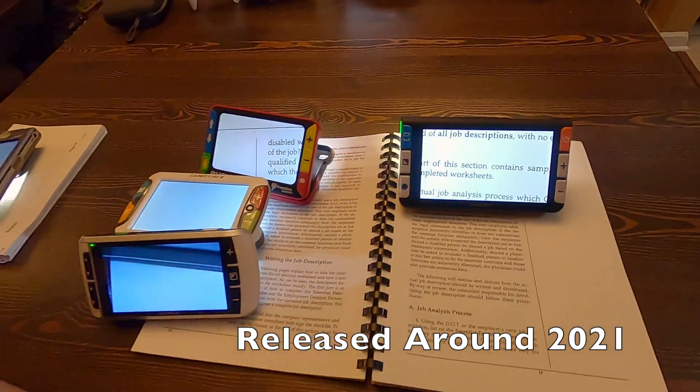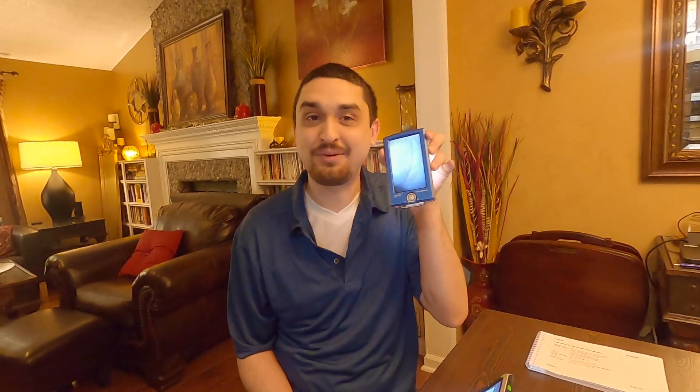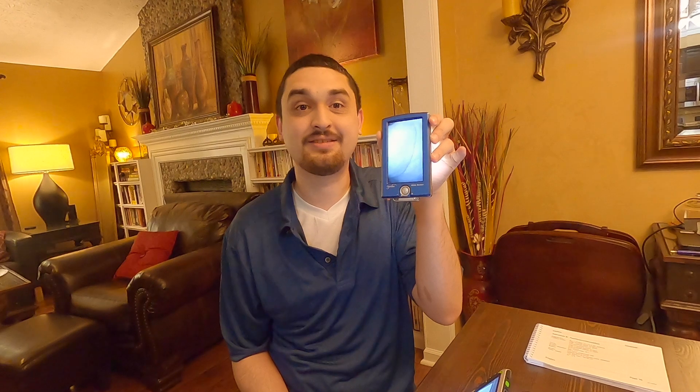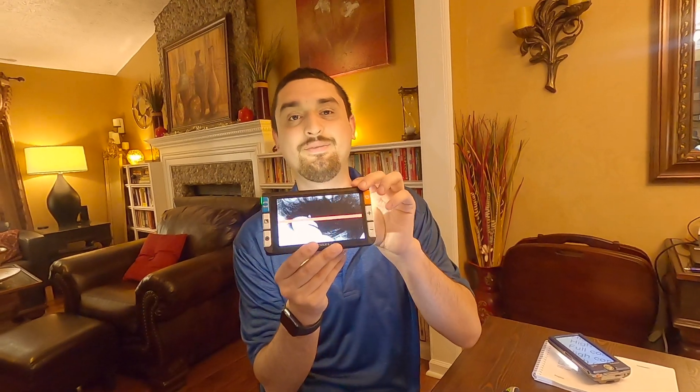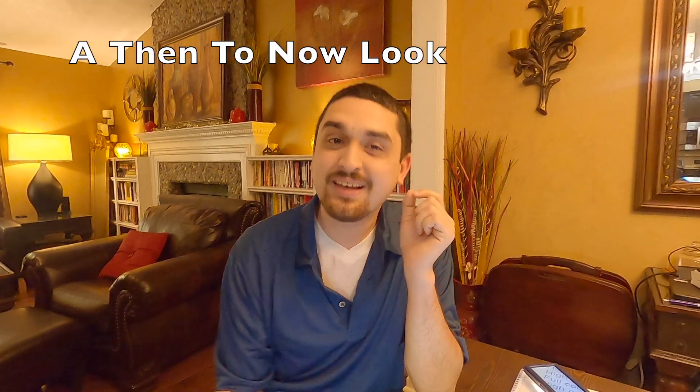So you can see kind of how we have progressed from 2007 with the Compact Plus, which is super bulky and super heavy, to now where we're at more like the Clover. So then and now — kind of an evolution, retro to today.